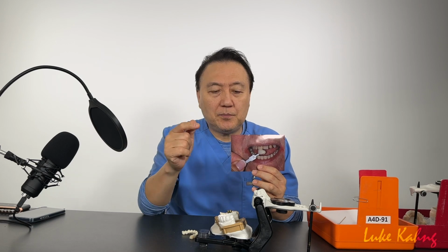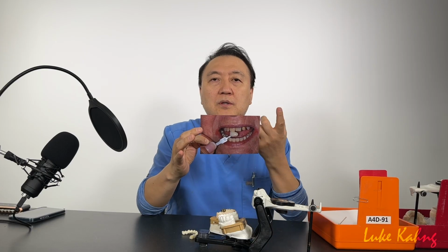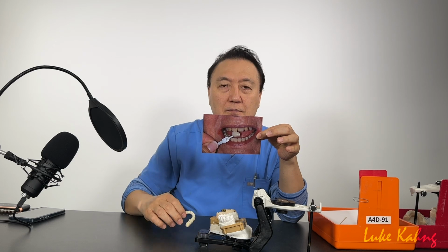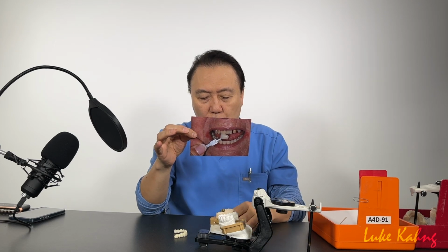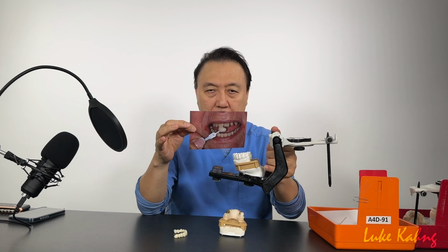In this case, the patient has bad teeth and the doctor is going to take out the old anterior teeth, and I got the model from the dentist. I can pull out the teeth just like the dentist, and I can make the concave areas underneath. And the tip is here: we have to know the tooth position, what it looks like along with the bite.